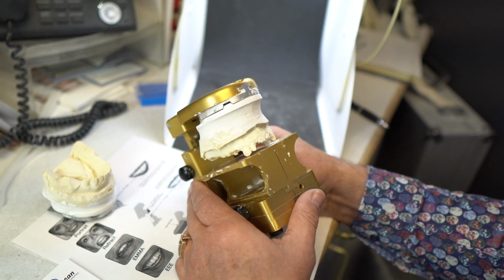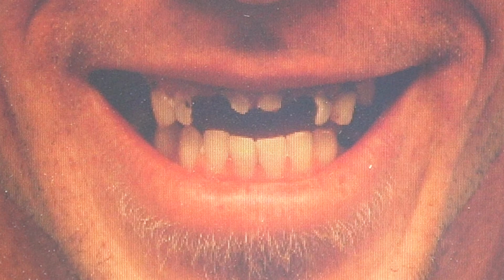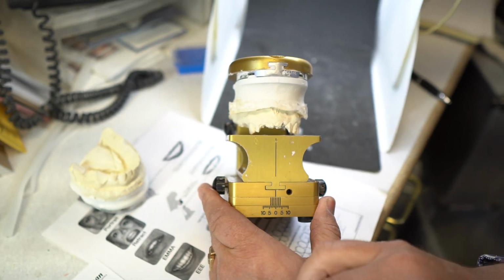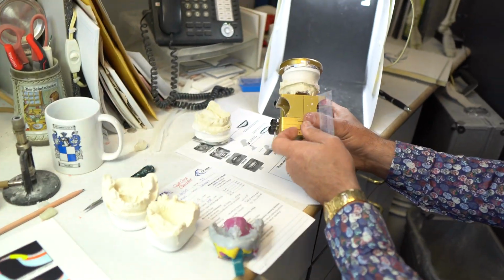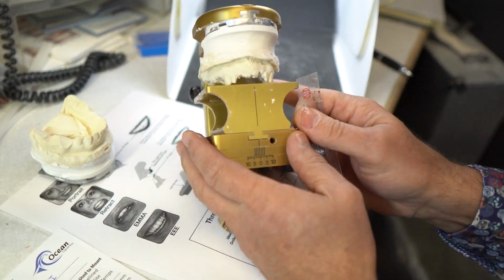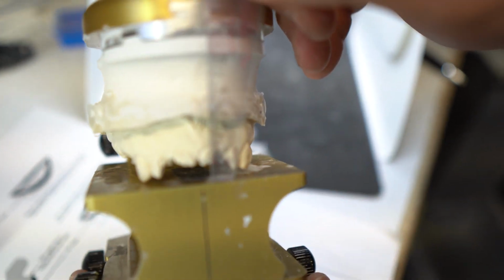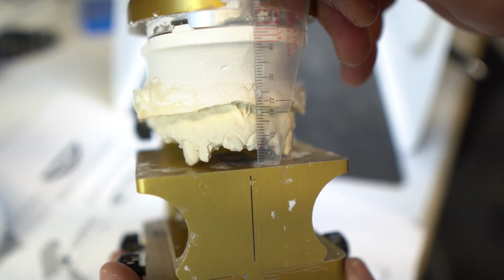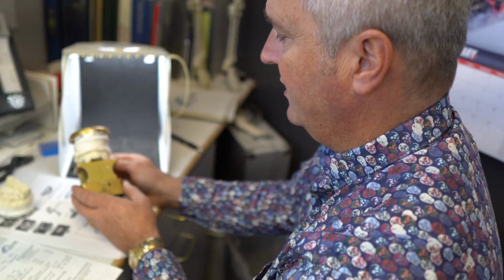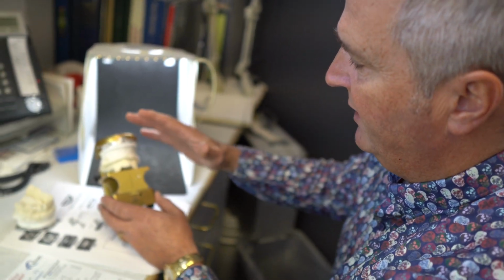Pictures will pop up of this so you can see what the patient looks like. And we pretty much have established that an 11 mil central will actually look really good on this patient. And we'll build that to this table, okay? So if you have a look there, it actually shows 11 mils to the table. We may shorten that slightly to 10, but that's an easy chairside adjustment to make it shorter, not longer. But we want to build a level plane of occlusion.